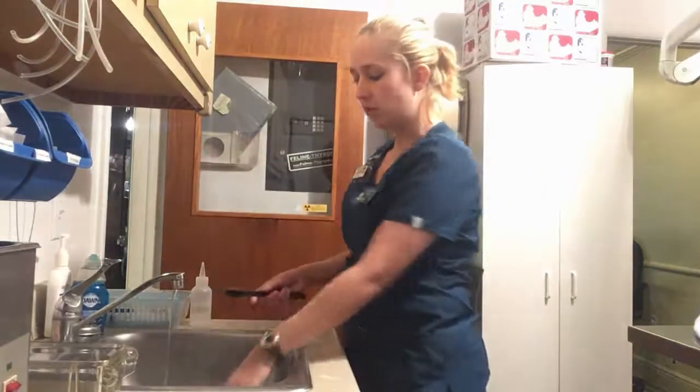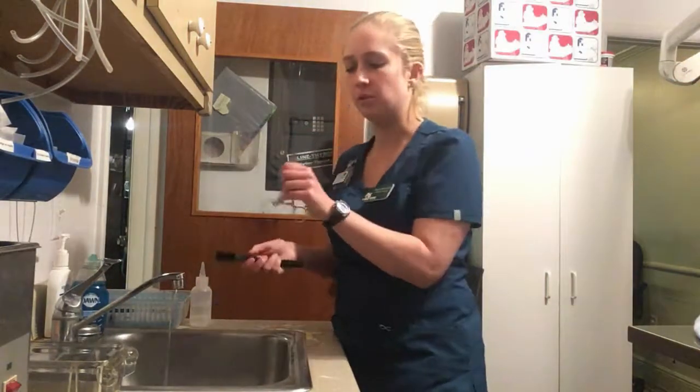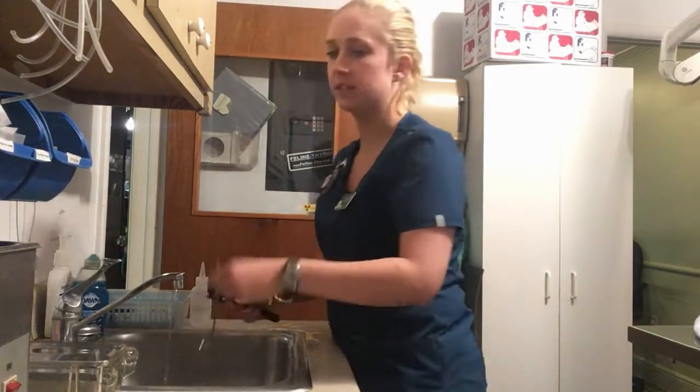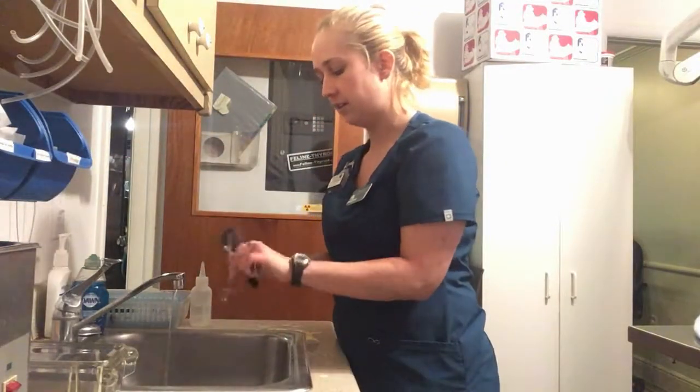When you're putting them in the ultrasonic shaker, you want to make sure to leave them kind of open. You don't want them closed, because that way you can still continue to get off all that debris and stuff that's left behind.